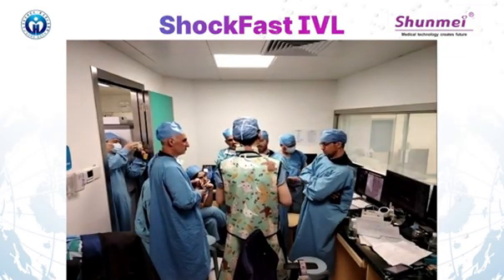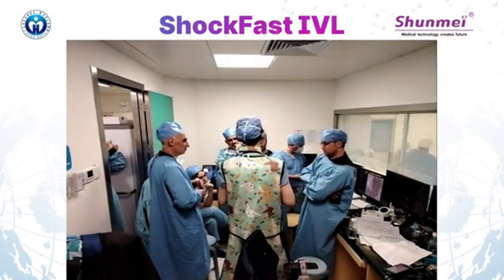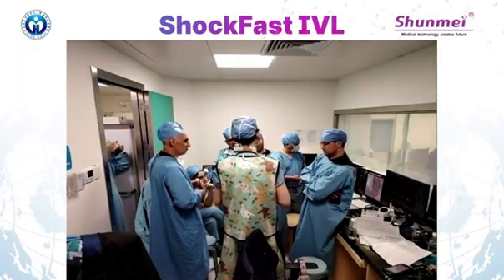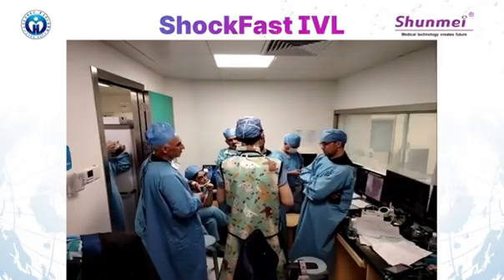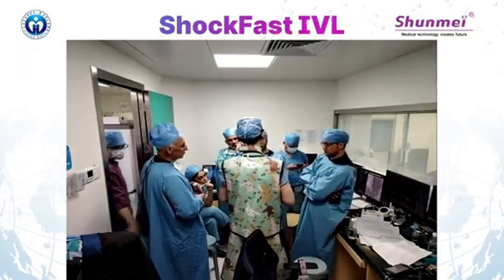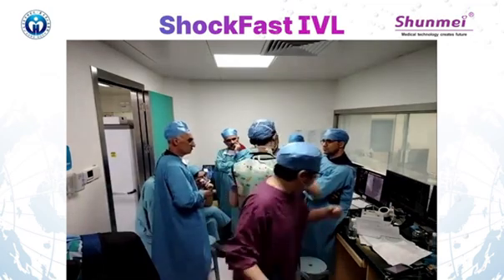Maybe first we choose a normal semi-compliant 2.5 balloon for mild predilatation, and then deliver the bigger IVL balloon over the extra support wire. I totally agree with you at this moment.